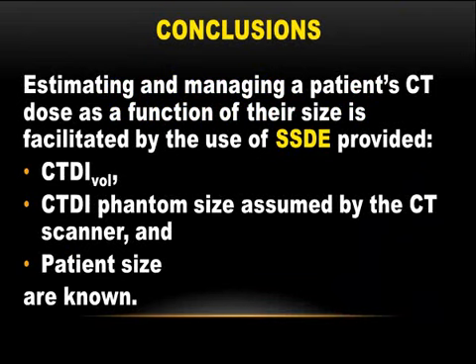So in conclusion, estimating and managing patients' CT doses obviously are important to all of us, and SSDE can help with all of these tasks. Thank you.